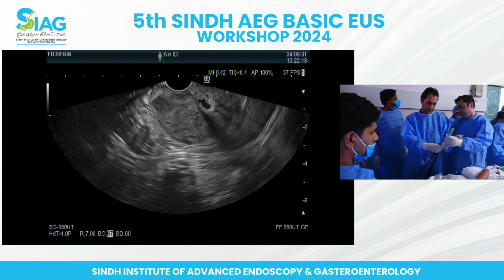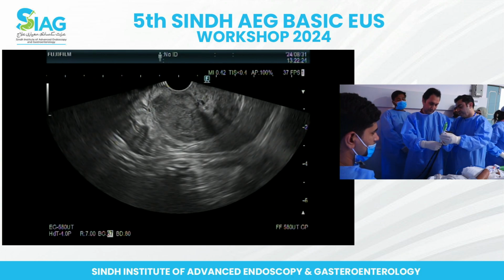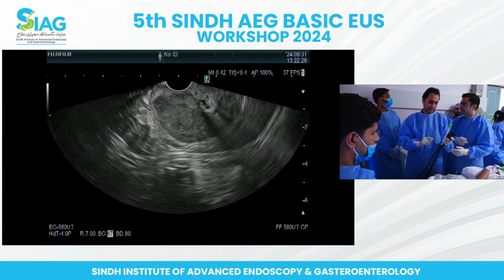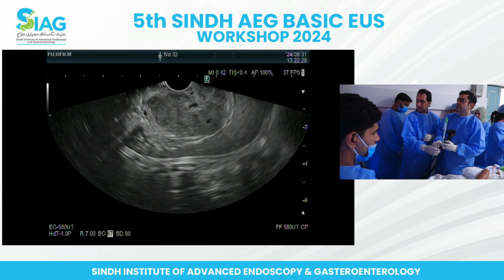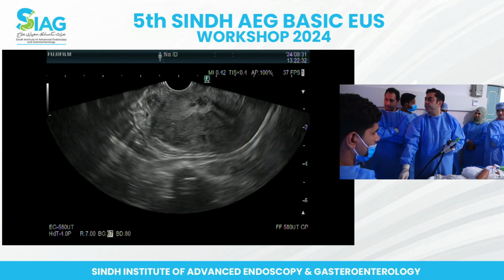If the sheath is sticking out too much, then it's going to hit the elevator of the needle and get bent and cause damage to the scope. Have you got it in? Yeah, excellent. So biopsy-wise, as I was saying, that's one point.